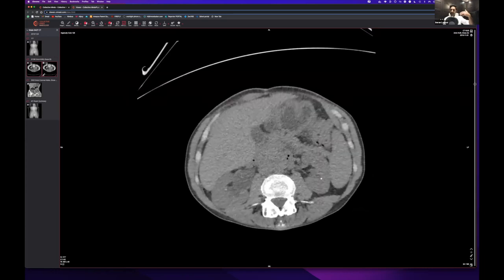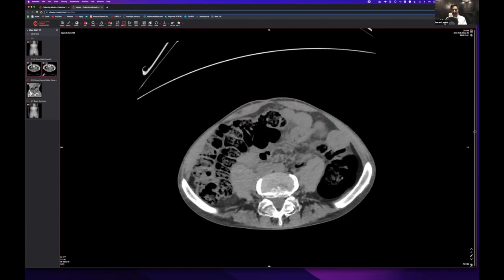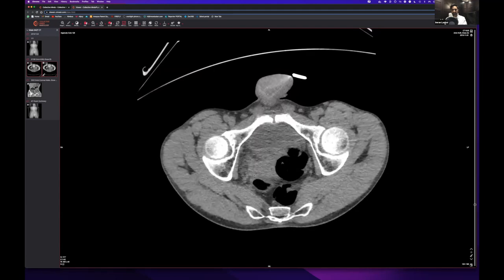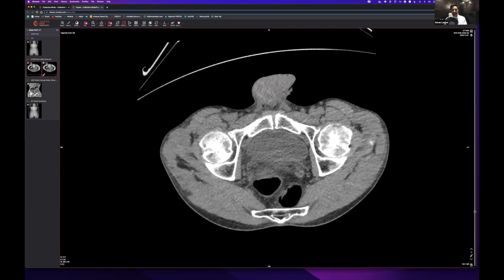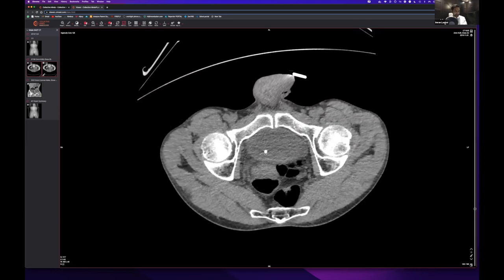I'll follow the ureter down — it takes practice. I can still see it here, here, still here — a bit difficult, a few vessels getting in the way. I may have lost it momentarily, so I work backwards and find it again: the ureter is going this way, and there is a calculus sitting here. Because it hasn't flopped forwards, this must be stuck at the vesicoureteric junction. So we've found the stone — but this is not a slam-dunk case, there's more to the story.